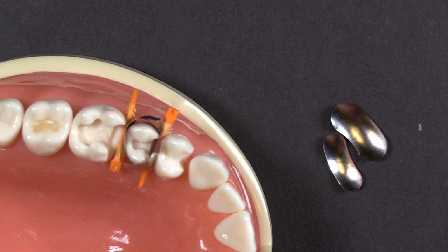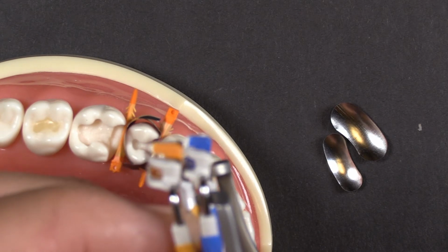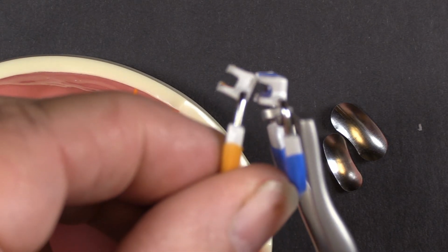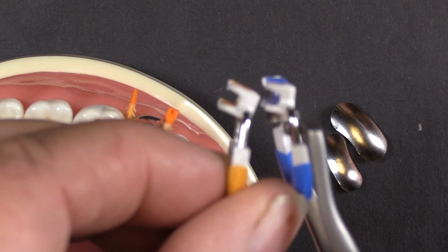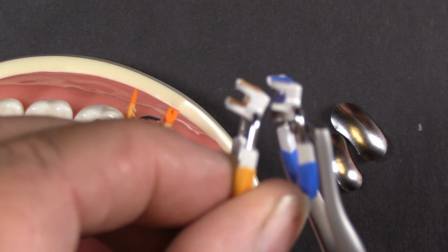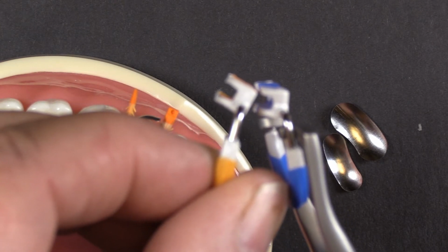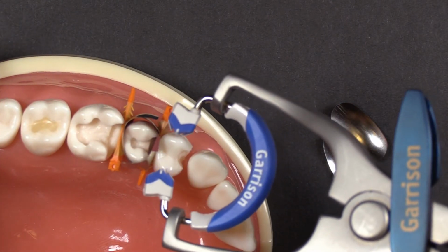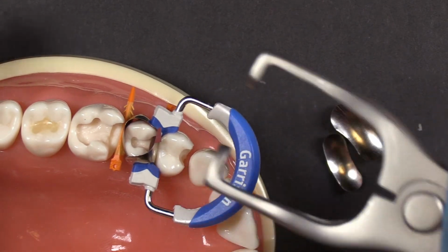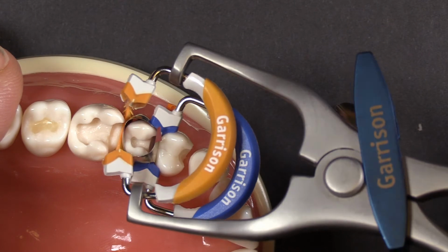And I'm going to put the short ring on first. Of the new fusion system, blue is the shorter one and orange is the taller one, and that's what we're talking about here. Really blue for short teeth, bicuspids, premolars, pedodontic situations, the orange for taller teeth, and also they stack a little bit more conveniently one over top of the other when you're doing an MOD. So I'm going to put the blue ring on and bring the orange ring over it very carefully.